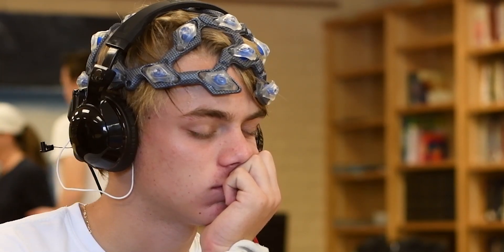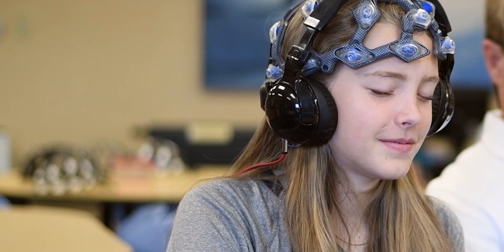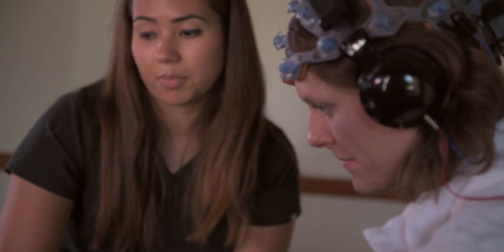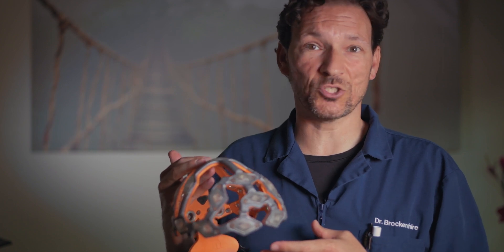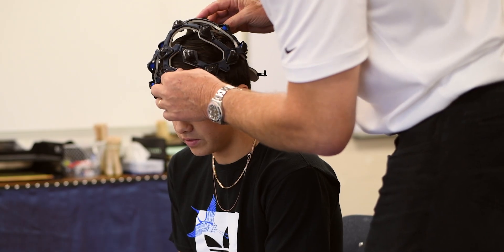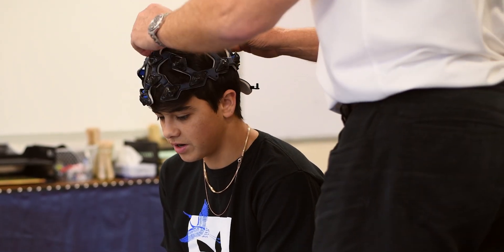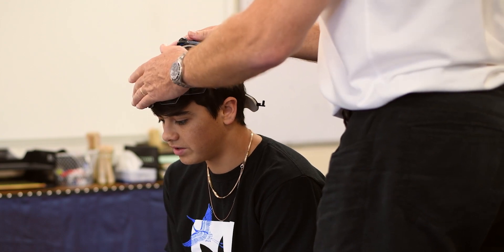And they're not just going out and wondering what it all means, but they're competing with themselves. So now your patient has a vested interest in truly making their mind and brain the best it can be. This technology is now a guide for me to see how our protocols are enhancing the human cognitive function and what we can do to enhance that further, particularly in students and athletes.